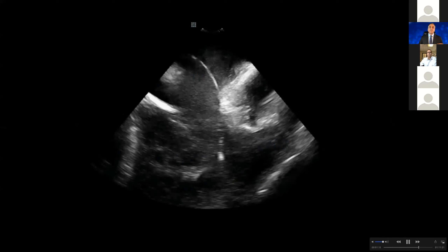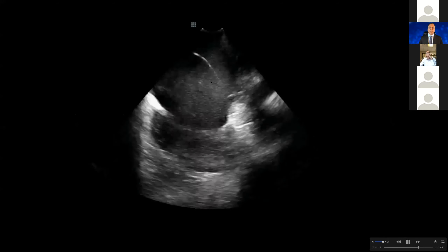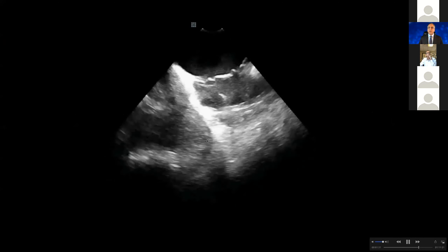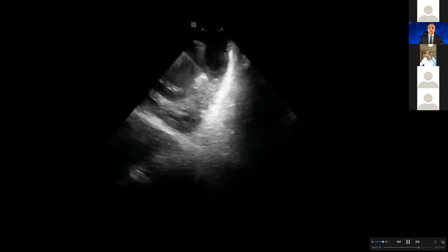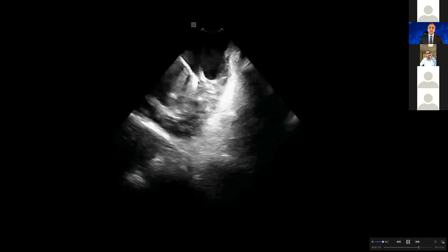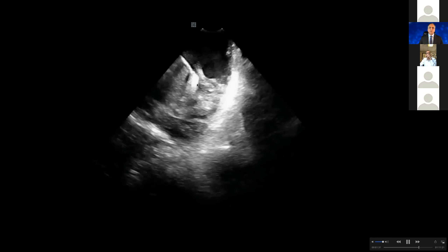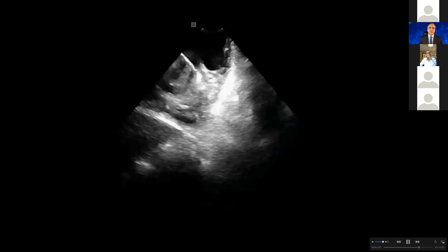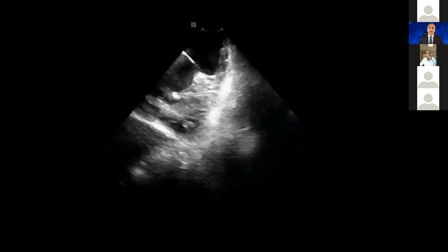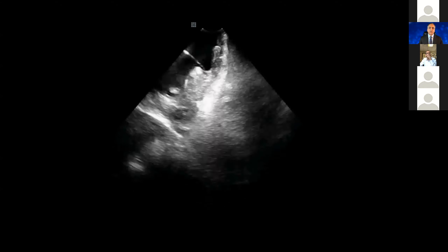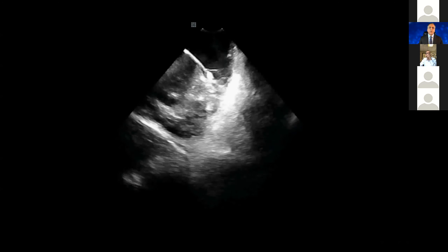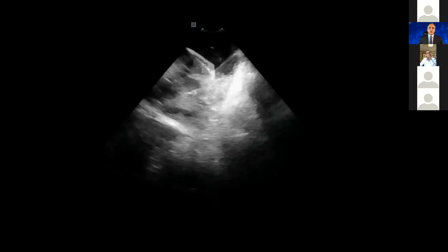Don't be satisfied. This is my ICE catheter — why not go down and put it inside the RV by performing an anterior tilt? As soon as I performed the anterior tilt, I was able to see my ablation catheter was right by that papillary muscle inside the RV. I was about 20–25 milliseconds early, but I said let me go to the other side because we had a small R-wave on the uni. As soon as I put my ablation catheter on the other side, I was able to get another 10 milliseconds earlier, there was no R-wave on the uni, and this was a very successful procedure.